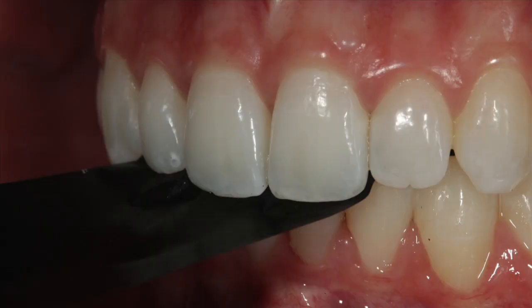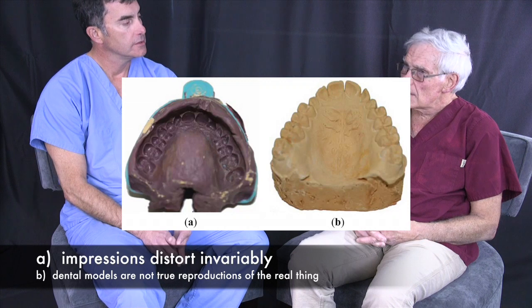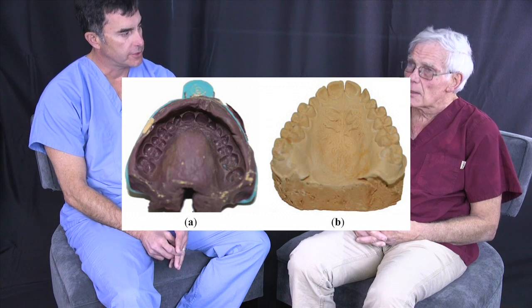Right. Can you compare, for whoever may be watching, what's traditional? Traditional really is articulating papers, waxes, coating waxes, and foils. Those three, and in particular, probably the least accurate is the use of articulating models. Yeah. And you say least accurate because? Least accurate because of inherent problems with expansion and contraction of the stone, and the impression material.